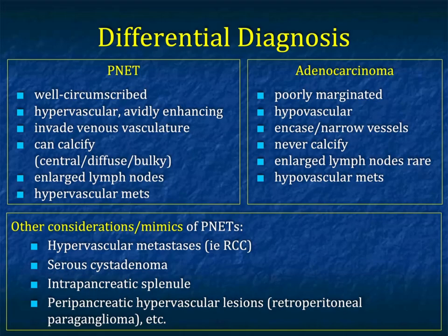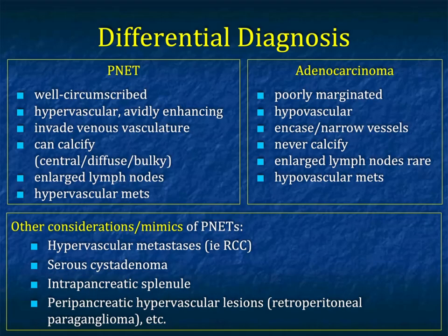Liver metastases from adenocarcinoma are typically hypovascular. With neuroendocrine tumors, they're often well-defined, hypervascular, and very brightly enhancing. They invade venous structures with a scalloping-type appearance, and commonly calcify — centrally, diffusely, or in a very bulky pattern. You can see enlarged lymph nodes which are vascular, and liver mets are typically hypervascular.